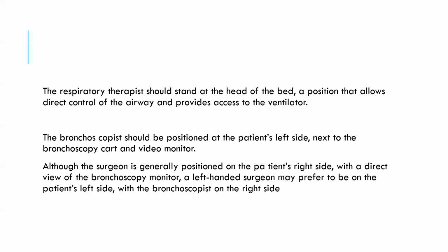The bronchoscopist should be positioned at the patient's left side next to the bronchoscopy cart and video monitor. Although the surgeon is generally positioned on the patient's right side with direct view of the bronchoscopy monitor, a left-handed surgeon may prefer to be on the patient's left side and the bronchoscopist on the right side.